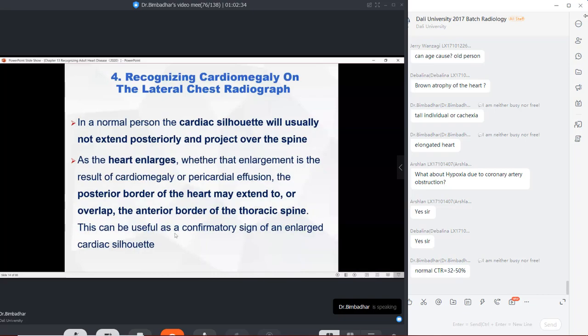What happens is that when the heart enlarges, it will overlap or silhouette with the shadow of the spine. So there will be obscuration of the shadow of the spine, a silhouette sign onto the thoracic spine, which will eventually say that there is an enlarged cardiac space. Okay, right? Enlarged cardiac muscle. So that is telling me that there is an apparent cardiac enlargement. Silhouette sign is also applied in a lateral projection.